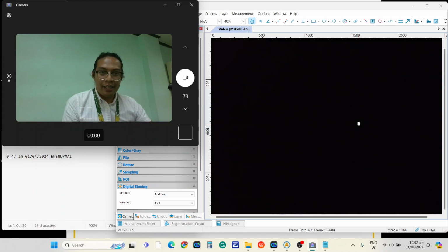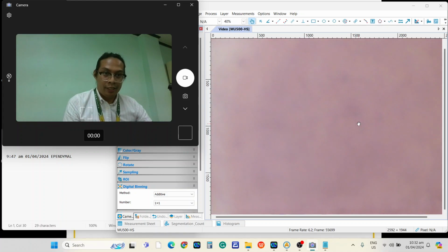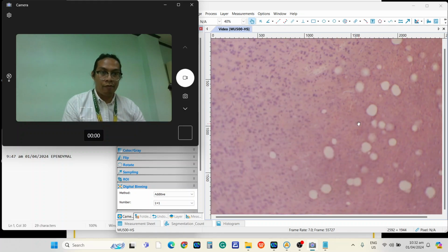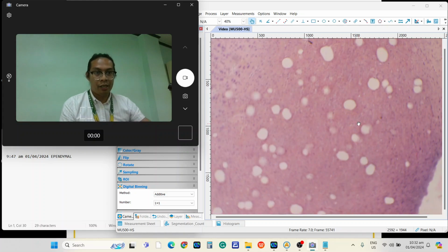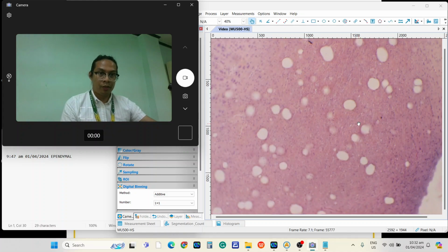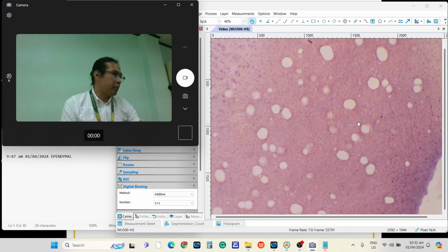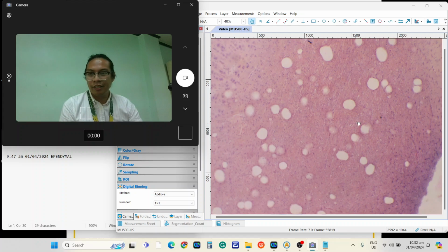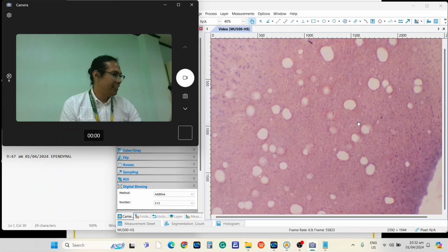Okay, so that is the gray matter of the cerebrum, and finally, again, the white matter. So, vacuolated. Baka meron siyang BSE. Actually, hindi. Natutuyo lamang siya. So, these are fat deposits sa white matter.